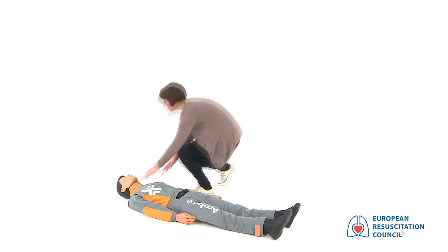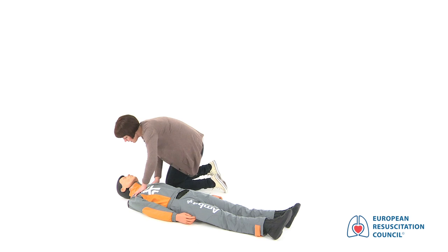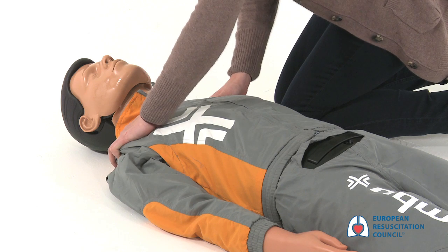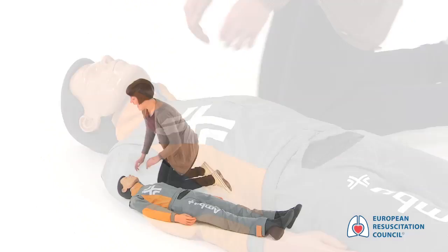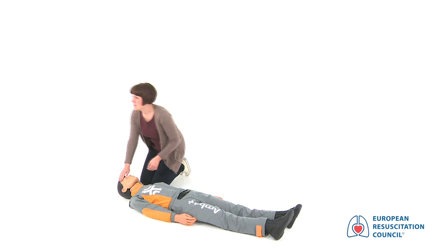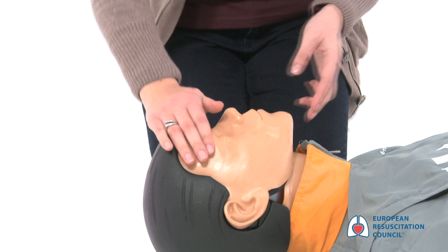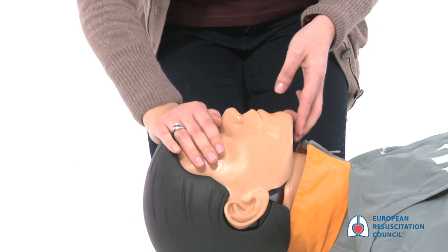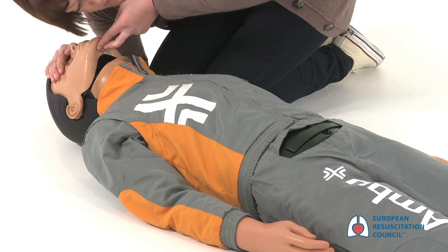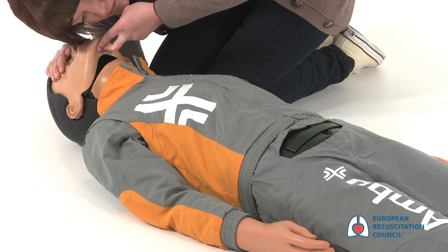Place the victim on his back on a firm surface. Gently shake the victim's shoulders and ask, are you alright? If the victim does not respond, shout for help. Open the airway by gently tilting the head and lifting the chin with two fingers. While holding the airway open, listen, look and feel for breathing for up to 10 seconds.